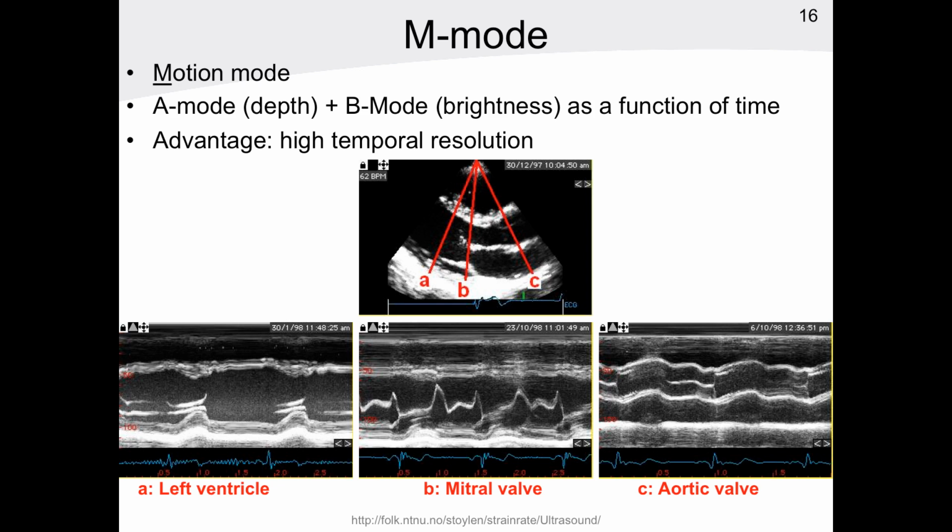Next is M-mode imaging. M stands for motion. M-mode ultrasound imaging is a combination of A mode, which helps us to get the depth along a single line, and B, in which the tissue interfaces are displayed as a brightness in the reflections. M mode displays this one-dimensional information as a function of time. Well, this ultrasound image is an example.